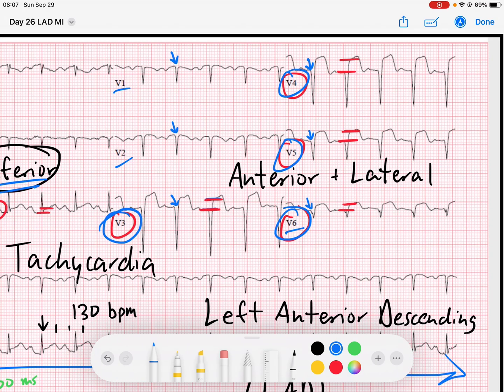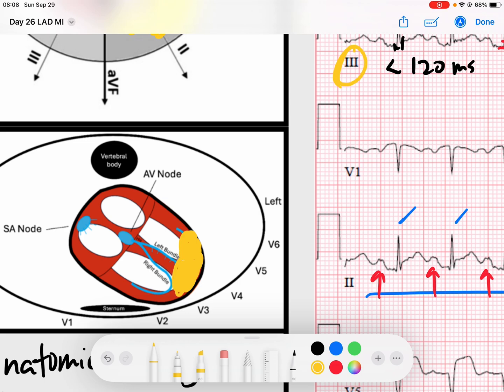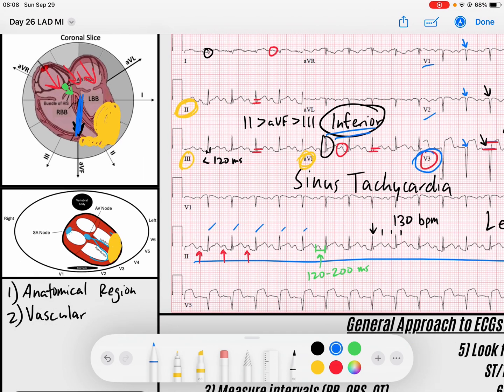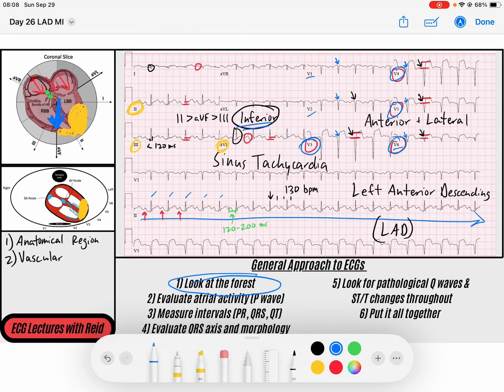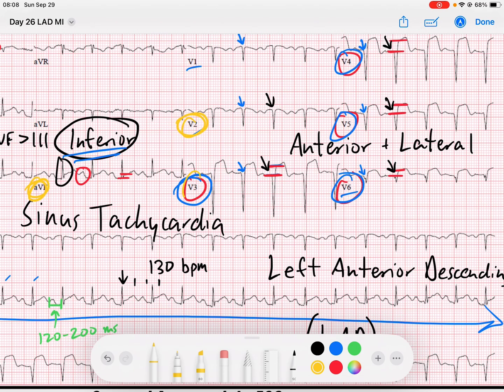Not only do I see big ST segment elevations, but remember there are not really many positive forces in the QRS complex. This is probably a late-presenting myocardial infarction — we're not getting many forces headed to the left side of the myocardium. All of this ischemic and infarcted area is not receiving signal, pushing those ventricular forces rightward — that's why the axis is a little bit on the right side. These pathological Q waves in V1, V2, V3, V4, V5, and V6 are telling me there's scarring within the myocardium, likely due to this large ischemic insult.